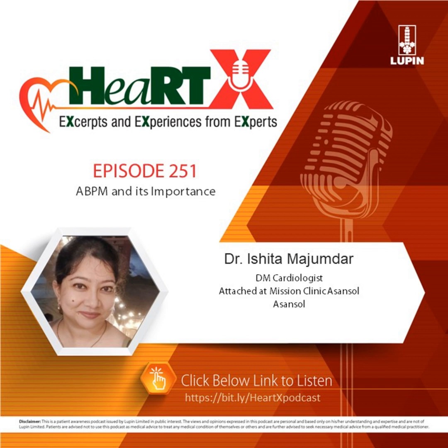In addition, ABPM is the single most effective tool to diagnose white coat, masked, and nocturnal hypertension and can help direct the treatment in such patients when required. Overall, ABPM readings can guide towards the prognosis of underlying organ damage and can be a useful predictor of cardiovascular risk.